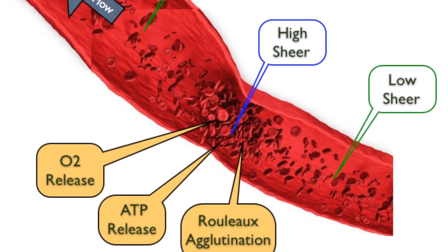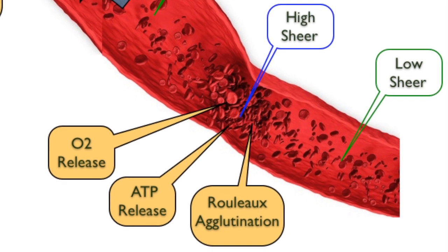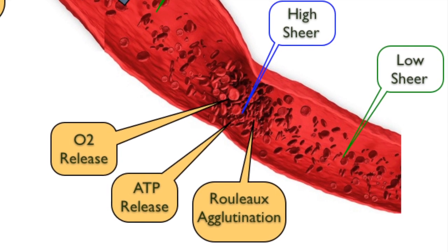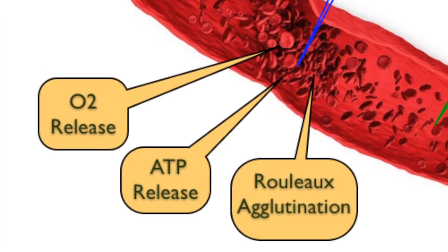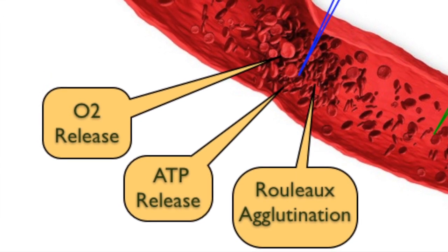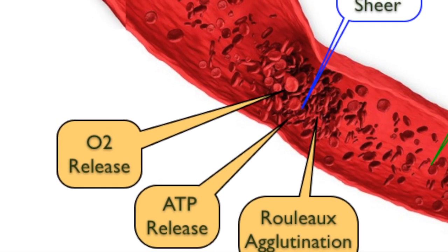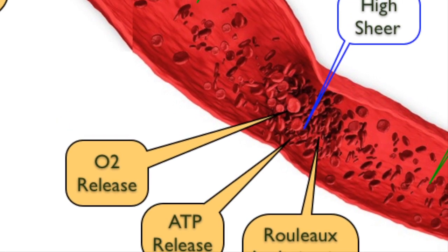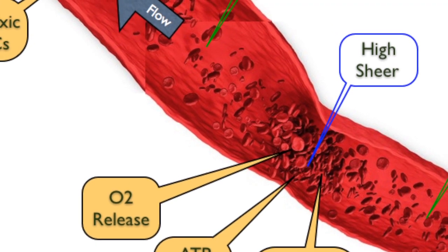On resumption of normal blood flow, the Rouleaux formations break up and disperse, returning to their original individual erythrocyte status. A high flow velocity can stop the formation of Rouleaux. As seen in the CBC results, a high hematocrit level can promote red blood cell aggregation and Rouleaux formation.